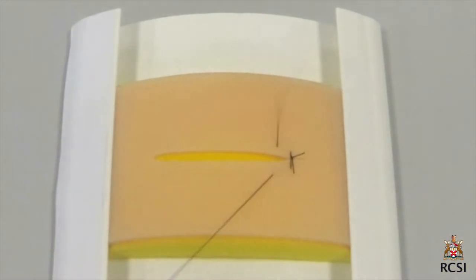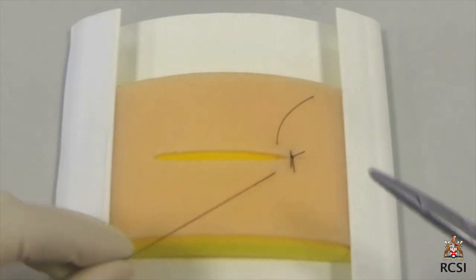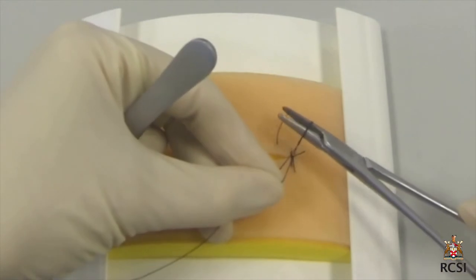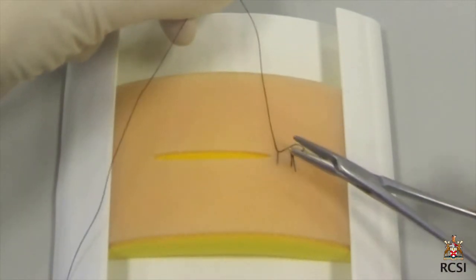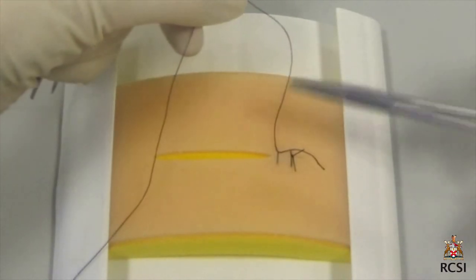In a simple wound, the needle can go through the whole wound in one go. The needle is inserted at 90 degrees and the wrist is rotated. Gentle pressure of the forceps in front of the needle helps evert the wound.